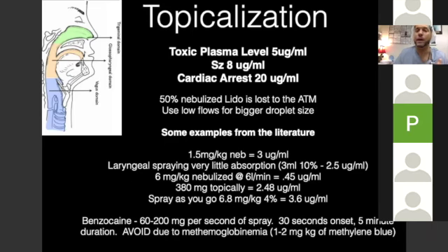But I do want to point out, anything you spray in the trachea is 100% absorbed. It's like giving it IV. So if you do a transtracheal spray, really count that towards your totals and ultimately apply all this information together to come up with a plan.